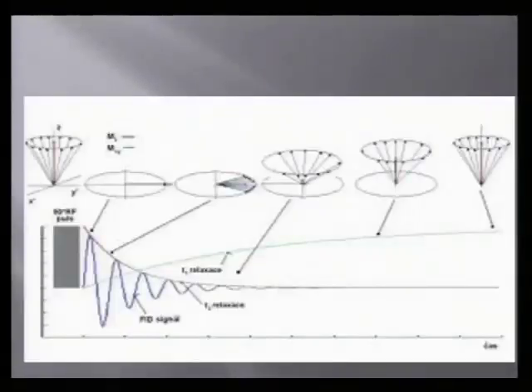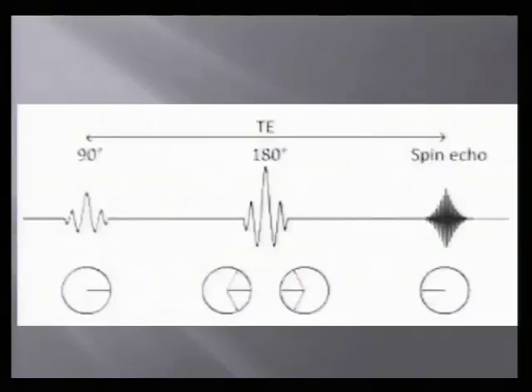So this is a very busy slide. It's trying to show both T1 and T2 weighting together, showing the dephasing and the refocusing of the energy to the lattice. Showing both of them together. They are mutually exclusive processes that are happening exactly at the same time, and we try to do certain things to alter the image characteristics based on the fact that the signal is being lost with both of these processes.